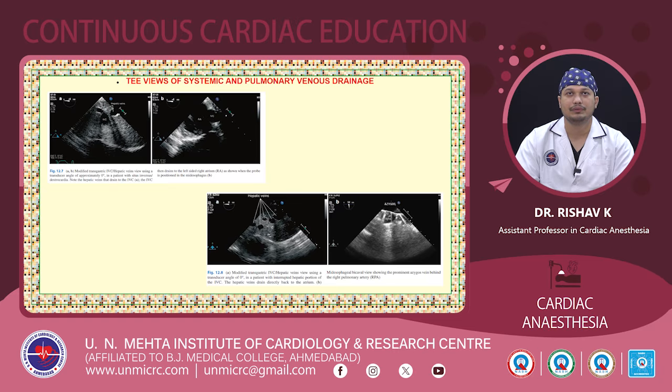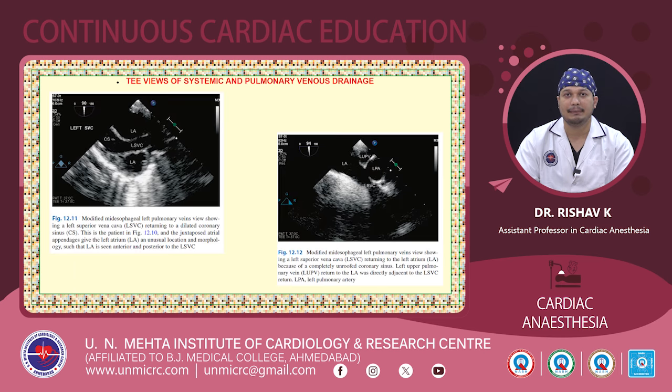These are the different views that we can use in order to evaluate the systemic and the pulmonary venous drainage. That is the top left image. It shows again the modified transgastric IVC hepatic vein view, whereby it is seen that the hepatic vein is draining into the IVC, and also the lower part of the slide where we see the presence of the azygos vein as well as the presence of multiple hepatic veins.